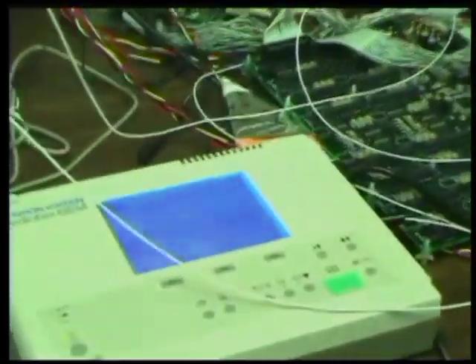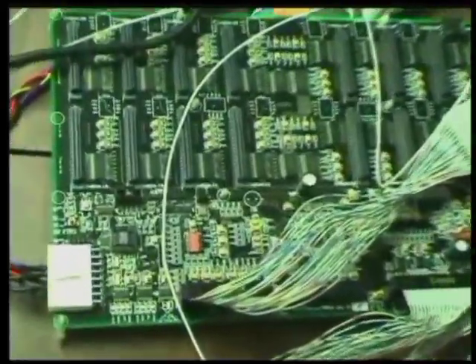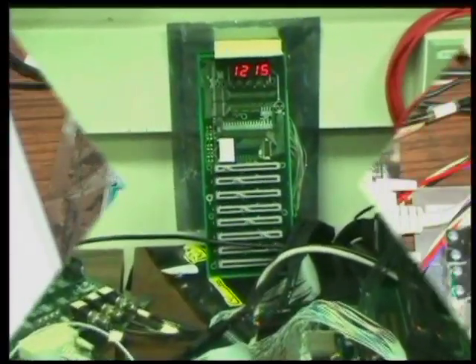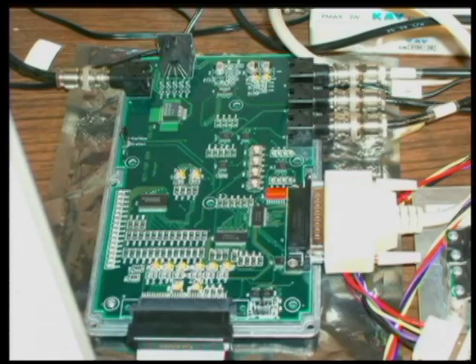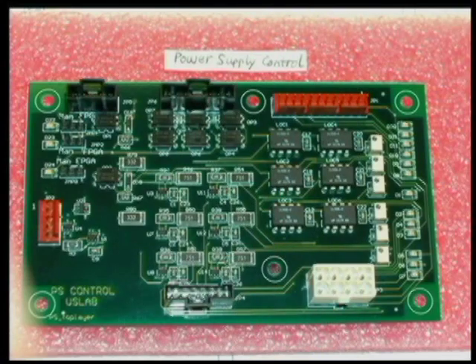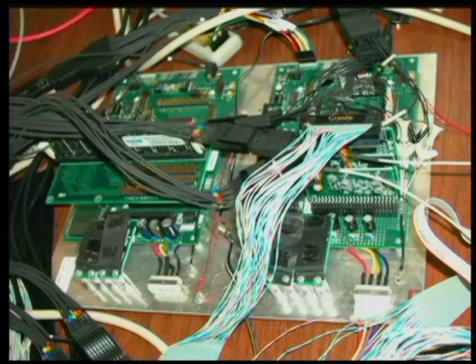These are completed boards, you can see, and then we use a digital logic analyzer. We have multiple boards.